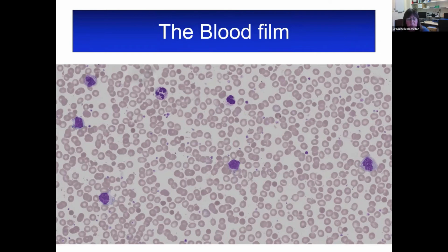But amongst the normal red cells, there is a variety of extremely dense cells with no central pallor, and we'd call these spherocytes. Interestingly, spherocytes seem to come in different sizes, and there are some quite small ones, which I'd probably call microspherocytes, although I don't think there's a specific size definition for that, but they're of interest. There's also some debris at the back of the slide.